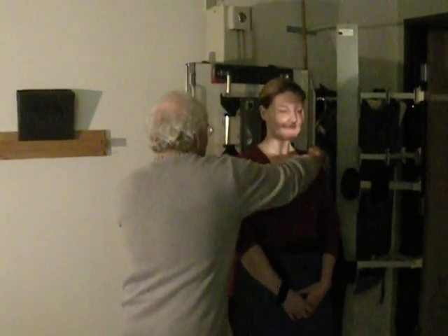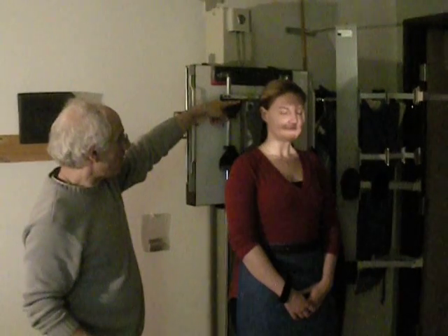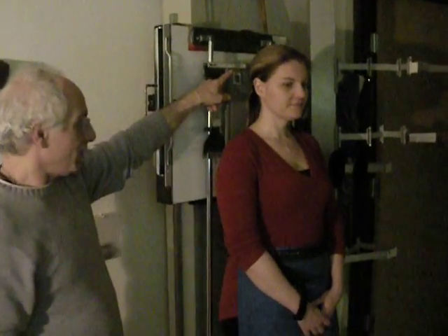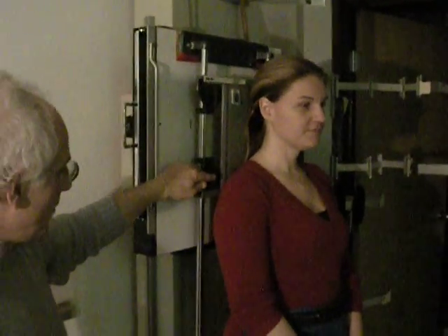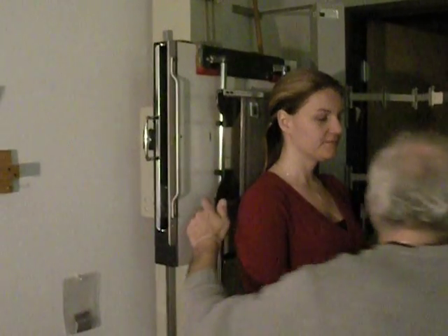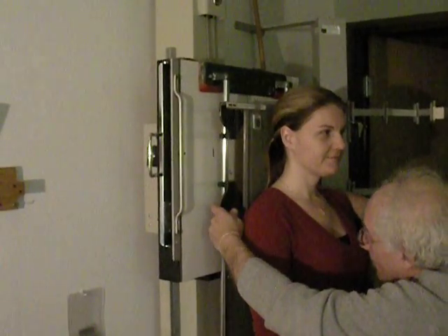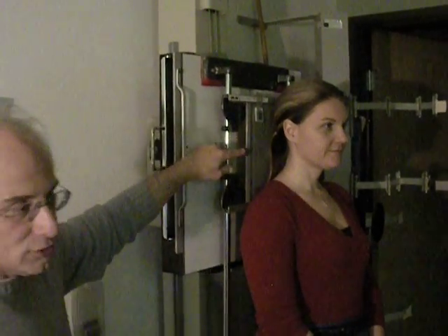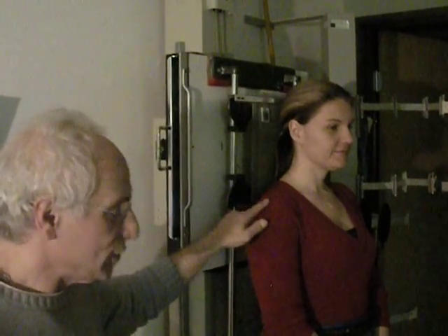So I'm just adjusting this film now so that the very top of this film is above the top of the ear attachment. I see now that film is placed underneath this patient's cervical spine, so that when the remnant x-rays land on the film, they'll have a place that's perfectly centered to do so. So I got 1, 2, 3 things centered to one another.